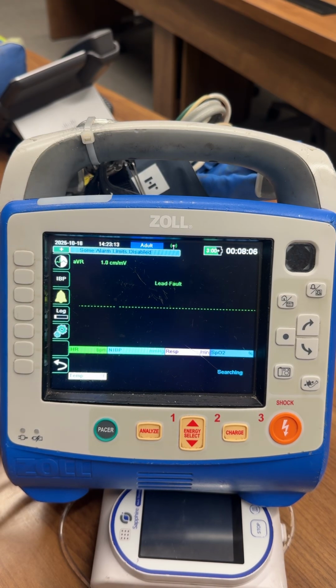We're going to go through the Zoll X Series monitor that you have on the aircraft. I'm going to hit this kind of hard and fast, and just know that we will get into this in a lot more detail when you start with your preceptors.